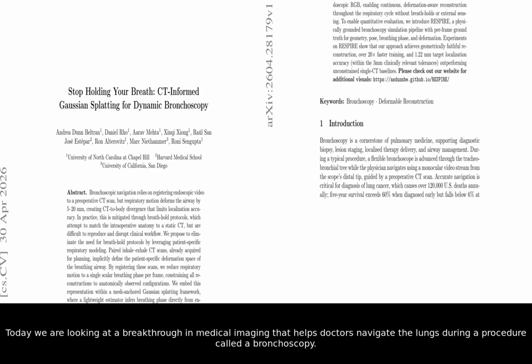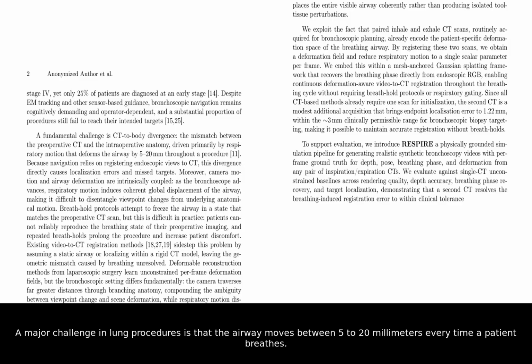Today we are looking at a breakthrough in medical imaging that helps doctors navigate the lungs during a procedure called a bronchoscopy. A major challenge in lung procedures is that the airway moves between 5 to 20 millimeters every time a patient breathes. This creates a mismatch between the pre-surgery CT scan and the patient's actual body, leading to errors in finding tumors or lesions.